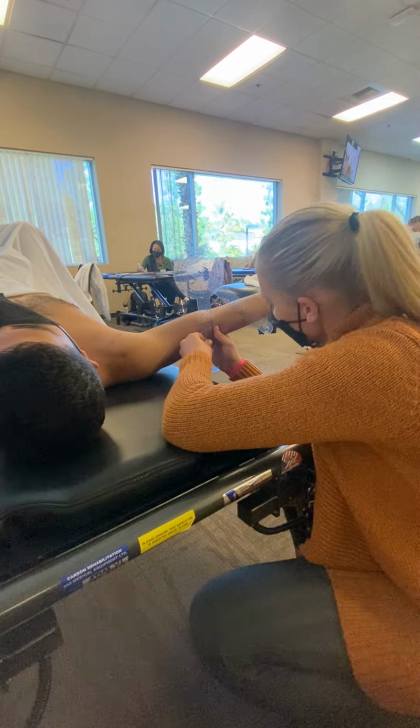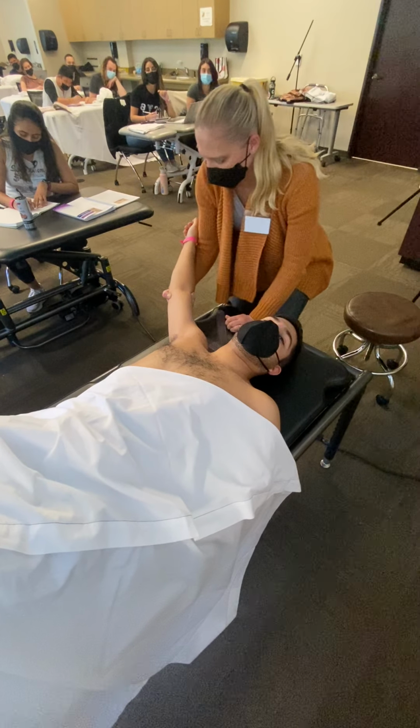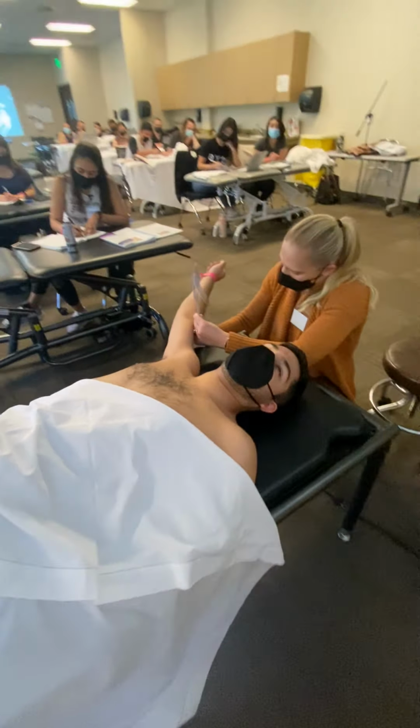So same thing, external rotation, supporting the arm, feeling at that shoulder to make sure that we're not getting any kind of compensations, bringing him down towards the table until I feel that first resistance. This one, it would be much easier to measure. I would recommend just measuring from the table, again, that lateral epicondyle to the table. He's at 9 centimeters here.